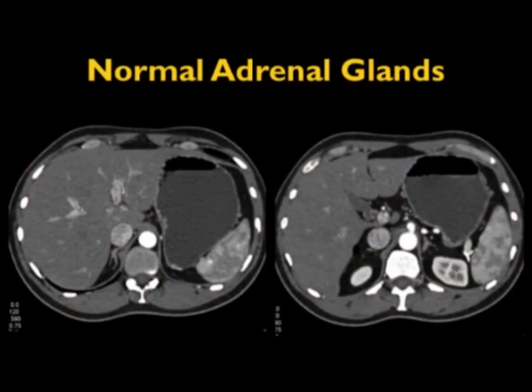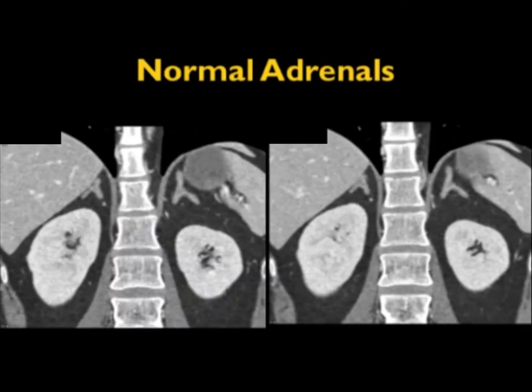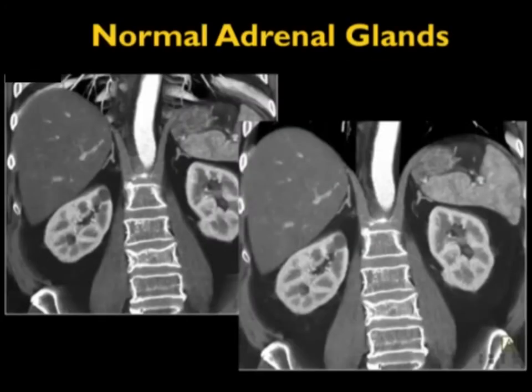They measure less than two or three millimeters in thickness. People talk about how many grams they weigh, but since I can't weigh anything on CT, I'm not worrying about the grams. You can see very nicely here two different adrenal glands seen again in the coronal view. It's also important to notice that the adrenals do enhance — probably to about 50 or 60 Hounsfield units when you're doing a fast injection.